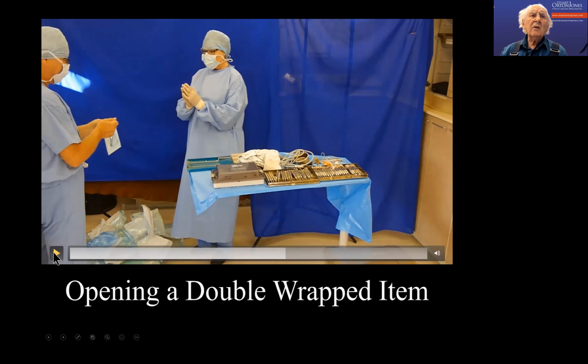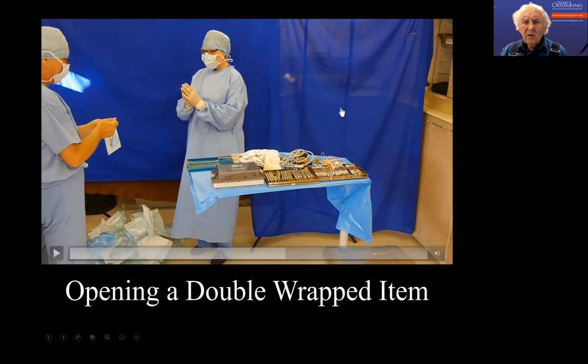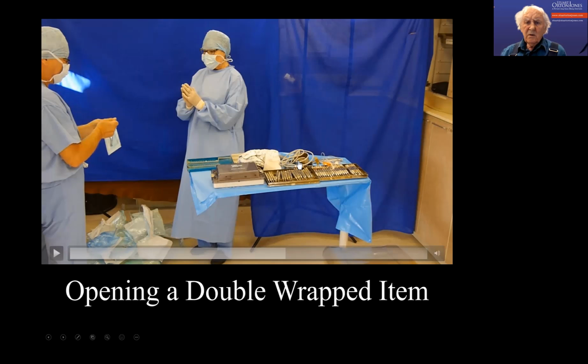Ashwin, do you know if you can... are you there, Ashwin? That implant motor cable is sterilizable. I didn't know that. Mine is, okay, and it makes such a difference because if this is not sterilizable, you have to use a sleeve to cover it, which is a real pain.